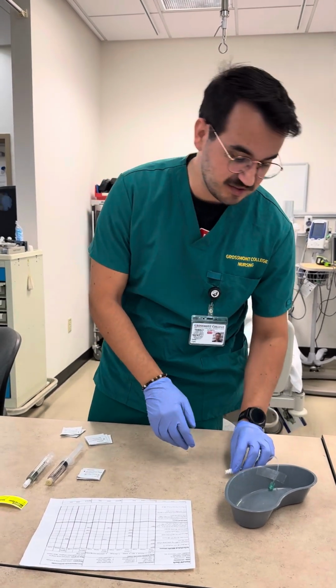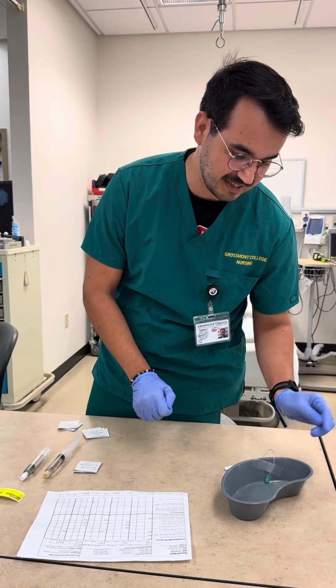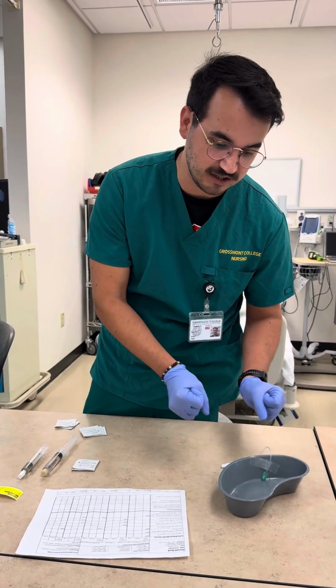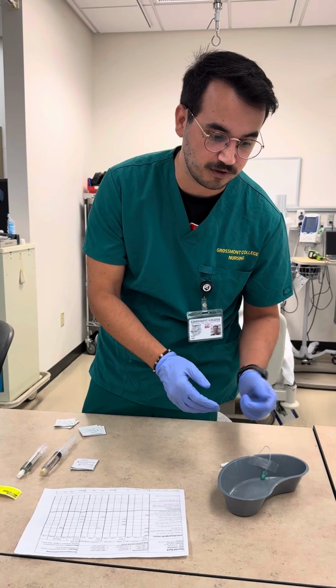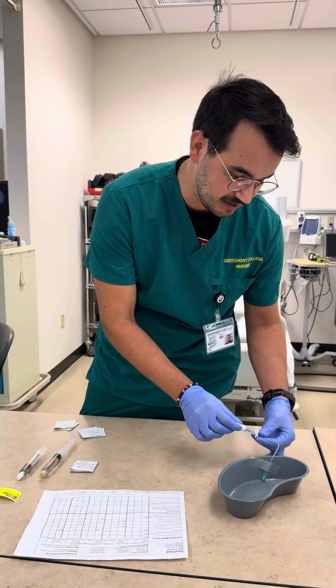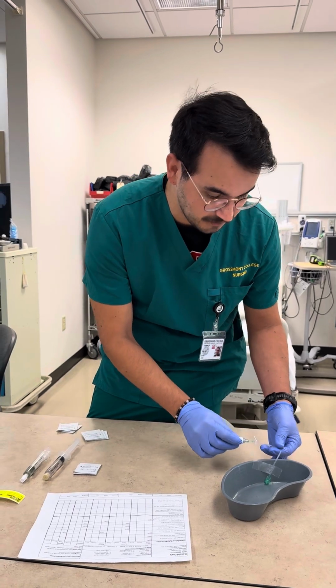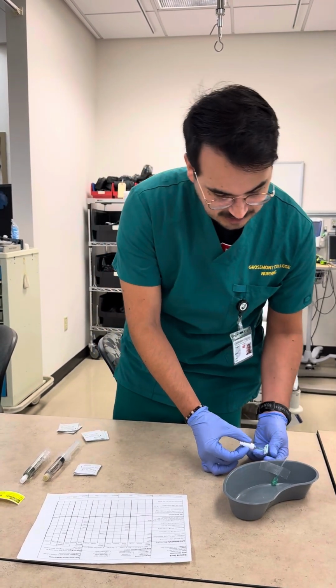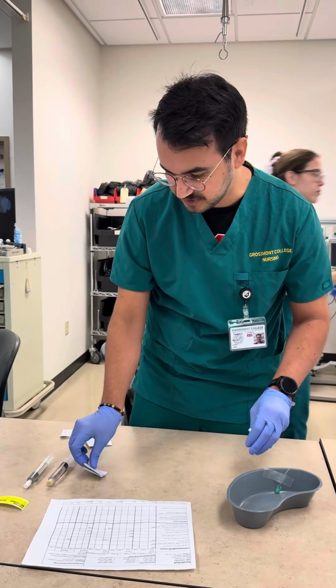So I inspect the site. I make sure to see that the dressing that is there is clean, dry, and intact, that the surrounding tissue is non-edematous and no redness or heat is observed when actually pressing. I would observe that the actual site itself is not kinked or damaged in any way. And I would get everything started.